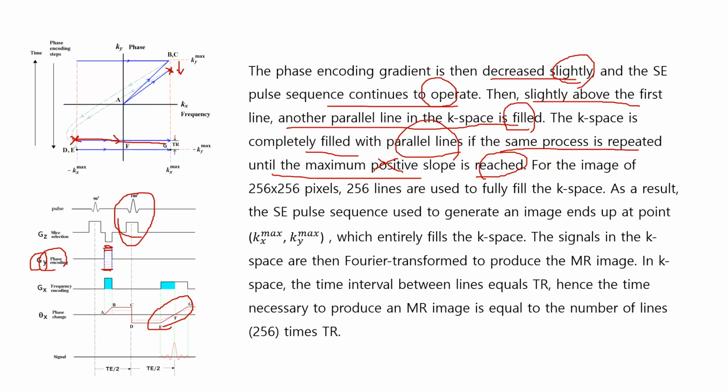Then we did this process 256 times. Then K-space is completely filled with data, MRI signals.